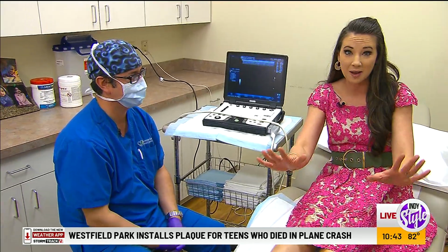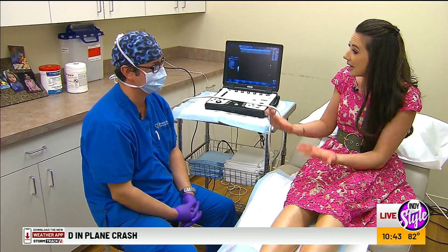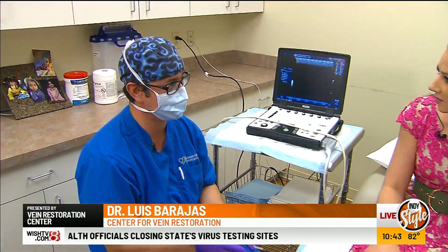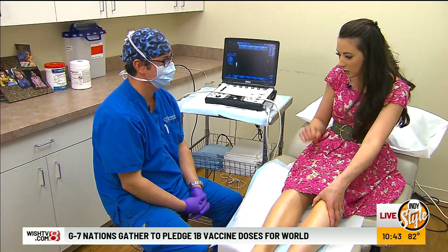So I'm a patient coming in. I have spider veins on my legs. I know other people have varicose veins, but walk me through the process and show me exactly how this works. Certainly. So we use an ultrasound to assess the vein, their function, make sure we don't see any clots. Look for varicose veins, and assess the flow pattern of these veins that are causing patient-like symptoms. So much that you can find out with this machine right here. Yes, absolutely. That's incredible. Okay, so how do we get started?